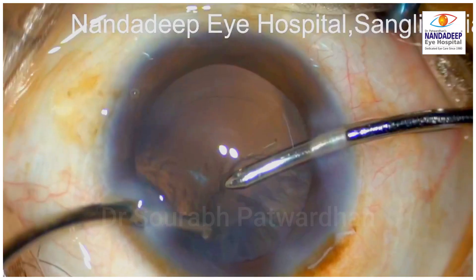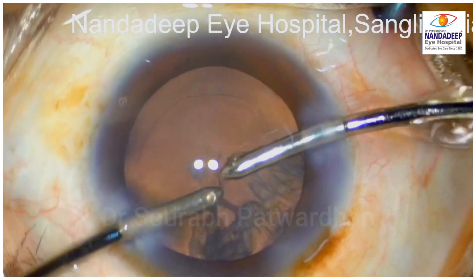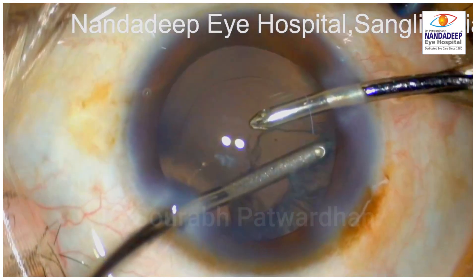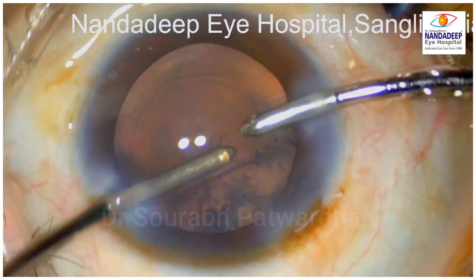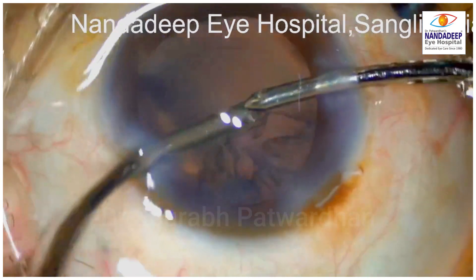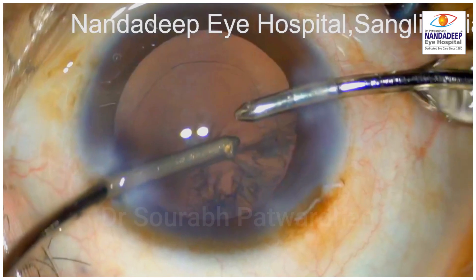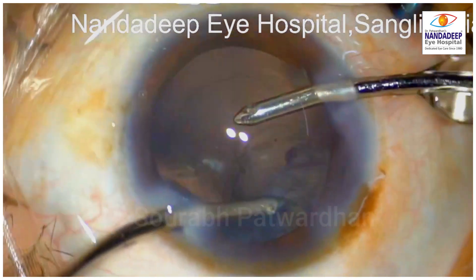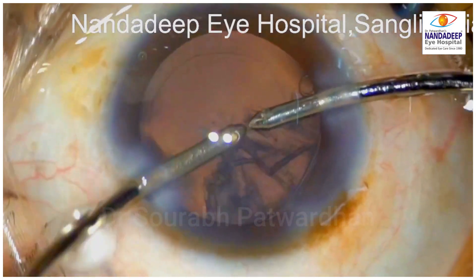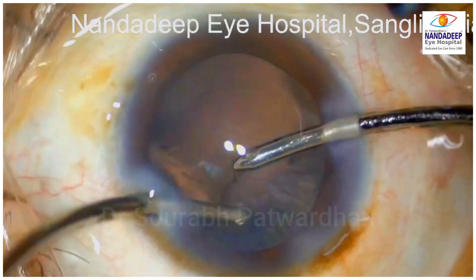You can try that by making a plane under the capsule using viscoelastic or fluid and trying to put the CTR in such a way that the cortex is not entrapped. But that is not always successful and you will have areas where cortex is trapped. There will also be areas where cortex may not be trapped and it will come out easily by the regular technique of centripetal pulling.